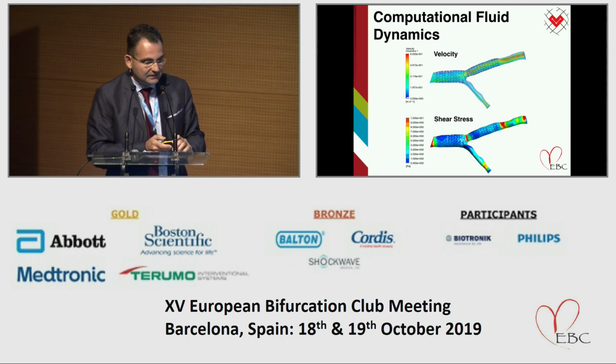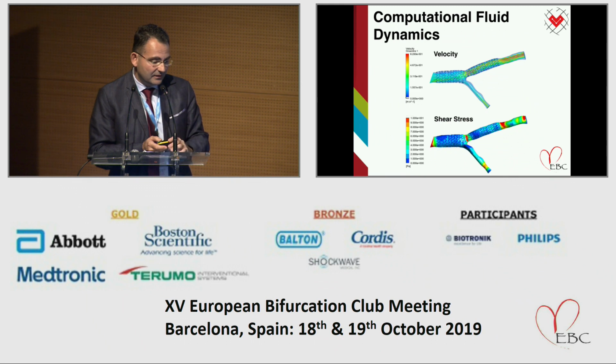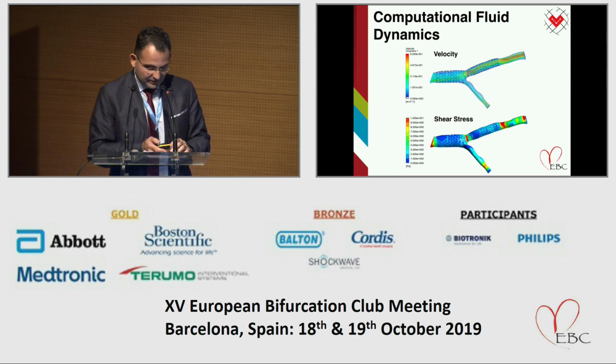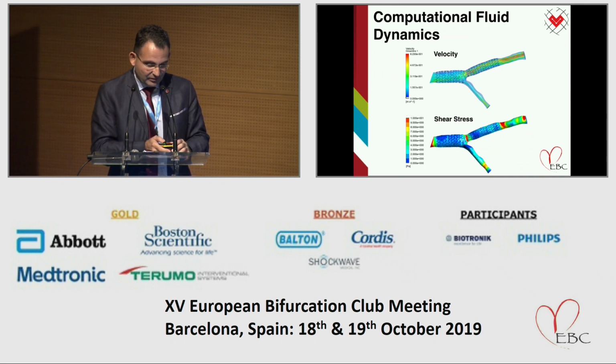And that's some flow dynamics showing in steady flow here that the proximal part, which is overexpanded, has achieved good homogeneous flow environment there, flow domain. There is no flow disturbance also on the side branch. Carina looks beautiful. And then distal main vessel also has good flow, with the exception of a little bit higher shear stress at the side of the very stenotic part, which was expanded with 3.5, but still it's fibrocalcific material, and it expanded to some degree.